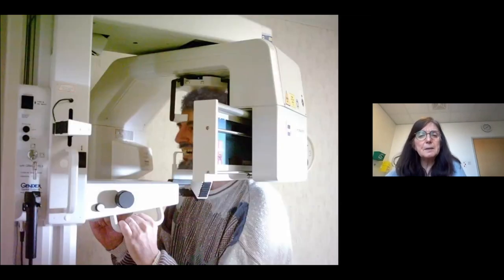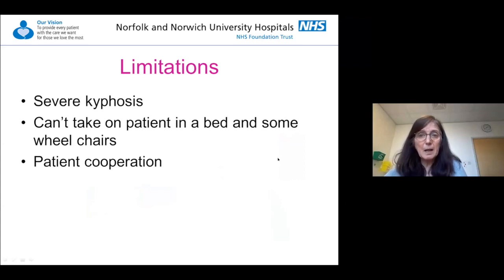So as you can see from this, you need to get this clear of the shoulders in order for it to work. So severe kyphosis can be a limitation. Similarly, a patient in a bed who can't get to stand up or sit up, again, that can be a problem too. And some wheelchairs where you can't drop the back of the wheelchair aren't suitable for taking an OPT. And patient cooperation. So it's limited how much cooperation we need for this radiograph, and most patients, including children, seem to manage it quite readily.